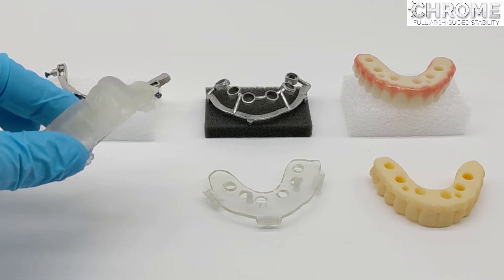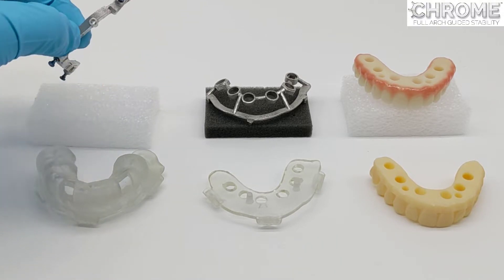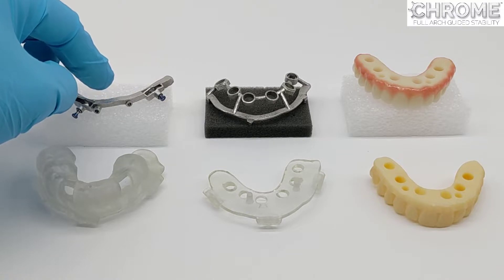The first item is the pin guide. The pin guide is what is used initially to deliver the fixation base. The fixation base stays in the mouth during the entire procedure.